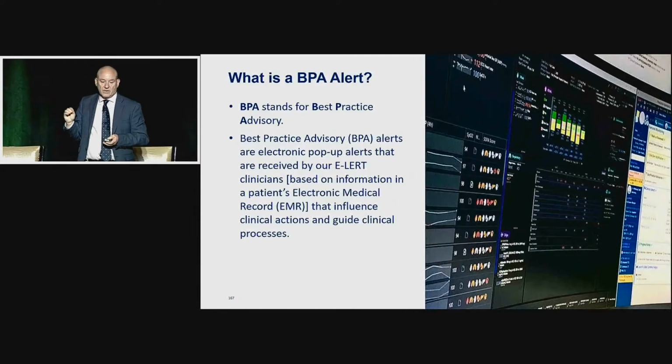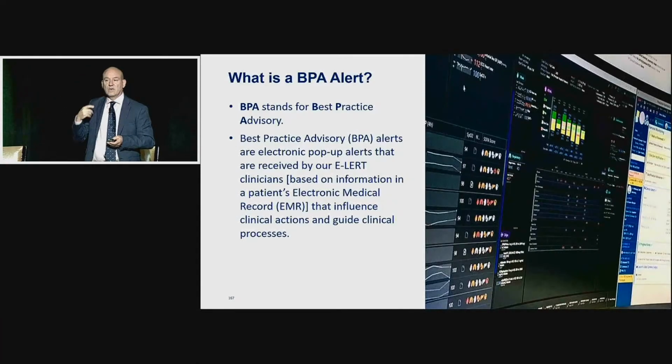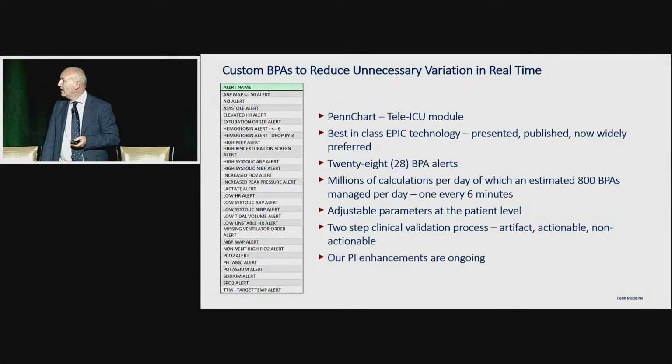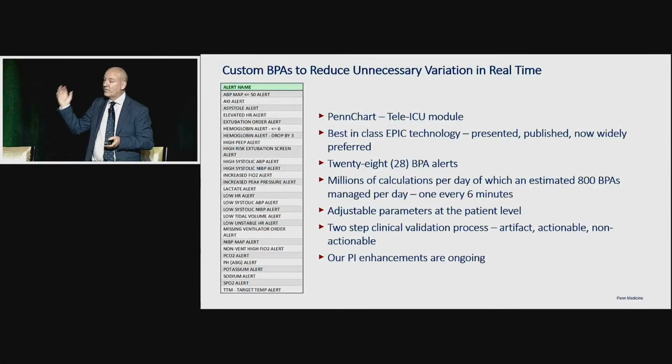But building best practice alarms was one of the key things, because I don't like all this noise from alarms. And this was a real opportunity, because we could finally not use the bedside monitor alarms. We could actually build our own alarms, some smart alarms. So this is what we did. We built a whole load of best practice advisories. They're not simple 1+1 pass-through. They're integrated, and we're making them more and more complex as we've now got live waveforms in. And the other key thing is they're adjustable at a bedside level.